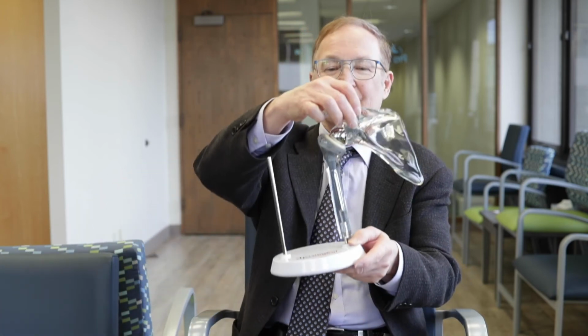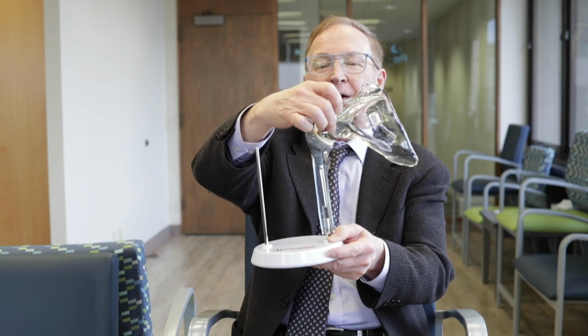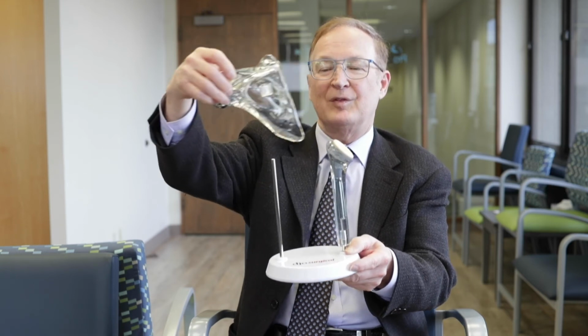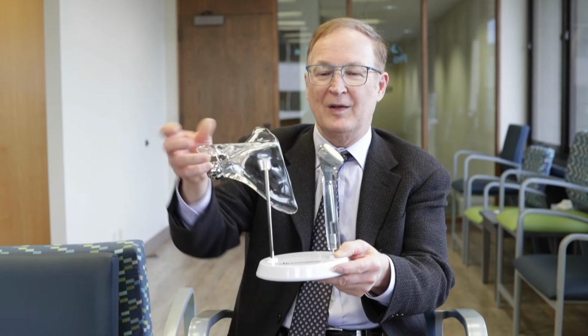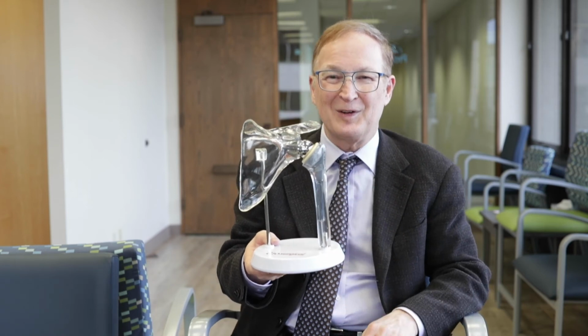Others came up with the clever idea, primarily in France, of putting the socket on the ball part and the ball on the socket part. And that's now, if we can't make a shoulder stay together, how we do it. Dr. Romano, interestingly, retired the very first year that we were able to do this operation. He did come by from time to time and see the patients. His prediction was it wouldn't probably work out, and it hasn't entirely, but it's been an advance.